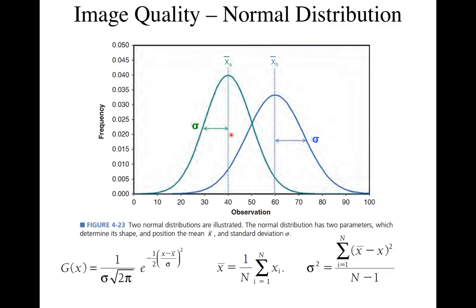It just doesn't matter if you sit on a pixel and do it 10,000 times or draw a region on the field of view that's of equal intensity and do my 10,000 in there. Right? For most of what we do in imaging, we just assume that's true, that we can just draw a region of interest and get these statistics.